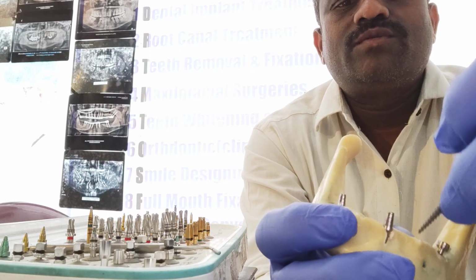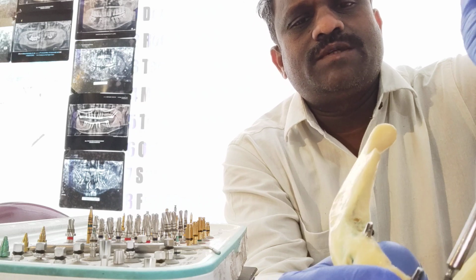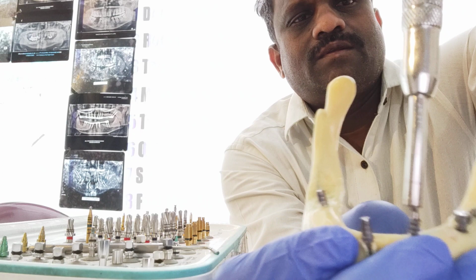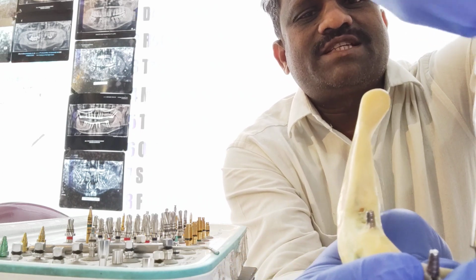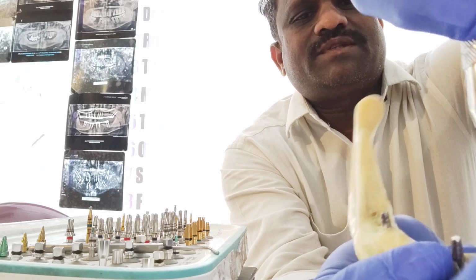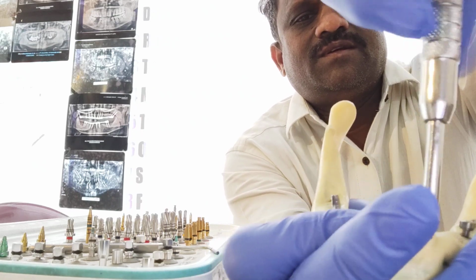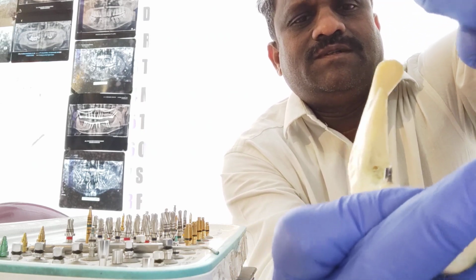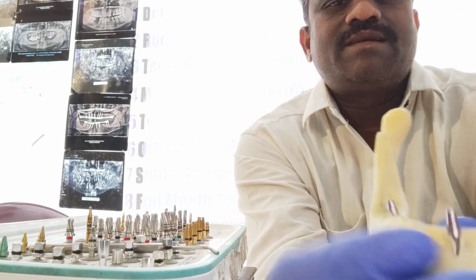So I'm going to place this here. Can you have a look? So actually the abutment is broken. I've used this implant just for prosthetic purpose. Okay, it's going. It will go. Yeah, I'm getting it. You should get good stability. That is the main thing.